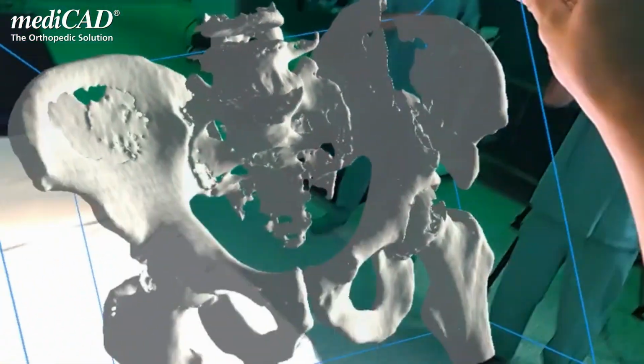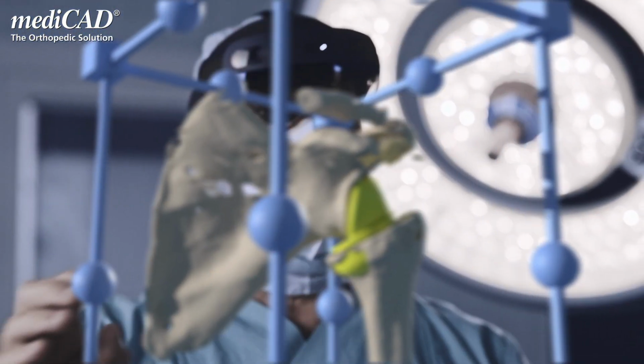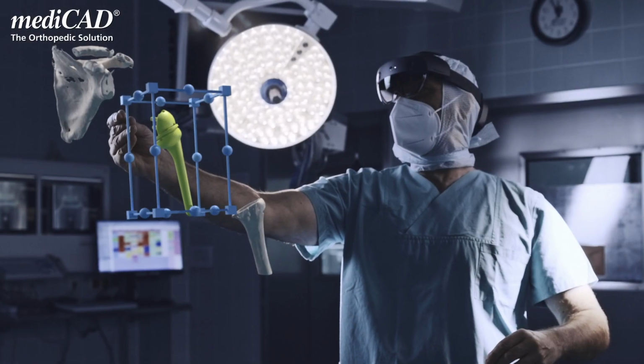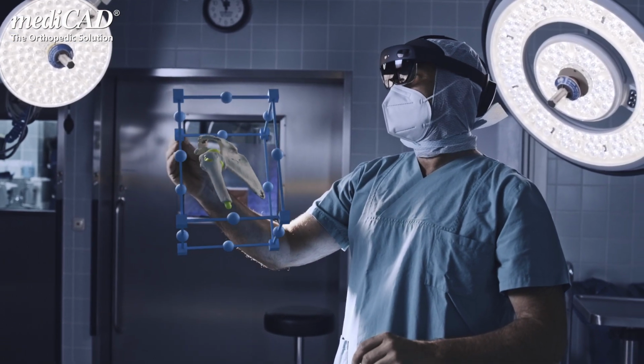This was very impressive. Once you've seen that the anatomy is in front of your eyes and you can see it exactly as it is, if you can then compare it with reality and then have all the three-dimensional planning data in front of your eyes, you simply don't want to do without it anymore. Because it gives us security, because it gives the patient security, and because sooner or later it will significantly improve the quality of surgical procedures.